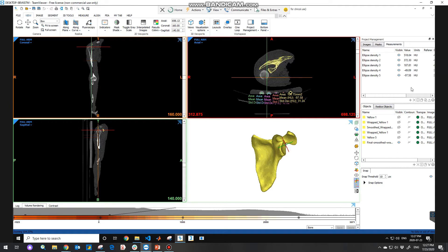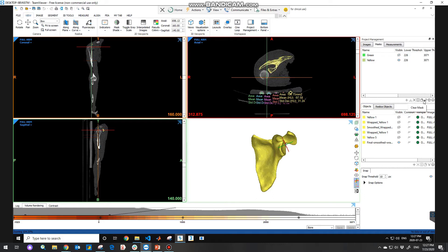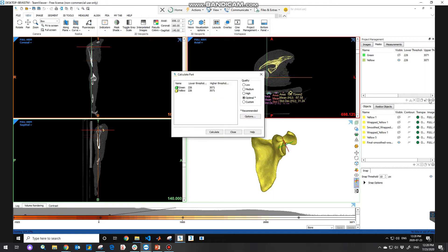Underneath the project management is a small toolbar with some functions to use for the masks, like the calculate part, clear mask, duplicate mask and so on. For instance, the calculate part will calculate 3D objects from the mask. This object will then appear in the screen below.